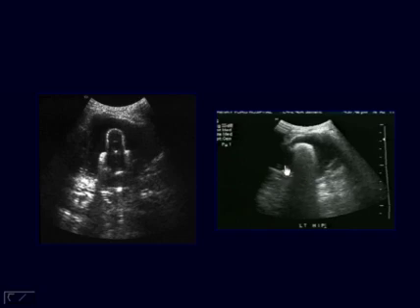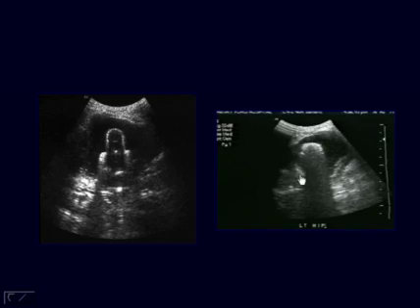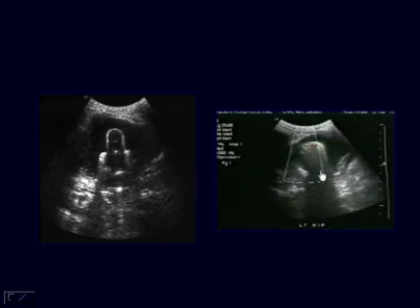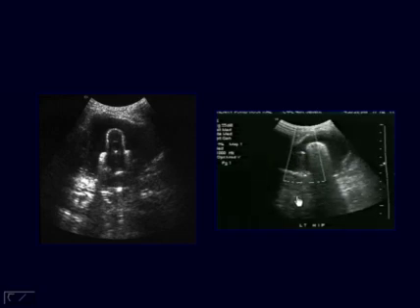Notice later on that while they're percolating on the dependent side, you can aspirate these same bubbles, a confirmation of what's going on. Here you see the tip of a needle that was a high-level echo. Employing Doppler one more time, we accentuate the tip of the needle. Sometimes it may be in color, but definitely it's high echo at this point. Notice that the bubbles that I mentioned are percolating on the inside part, and you could suck the samples from the dependent portion to the bevel of the needle itself. Confirmation indeed that this was positive, and usually for Staphylococcus aureus infection.